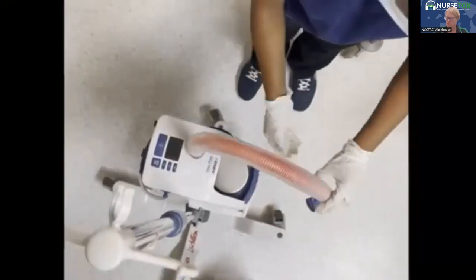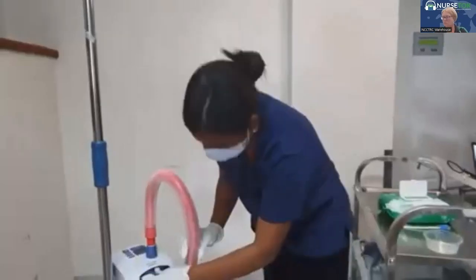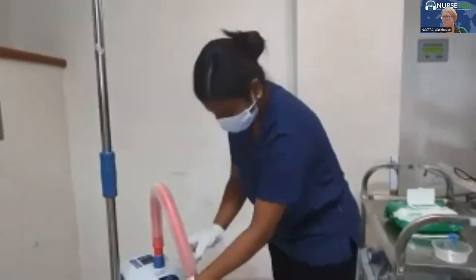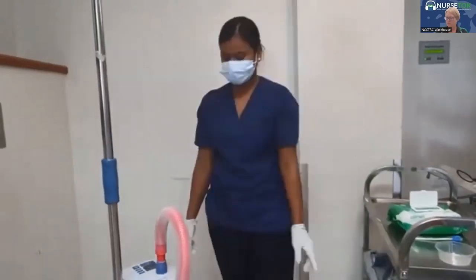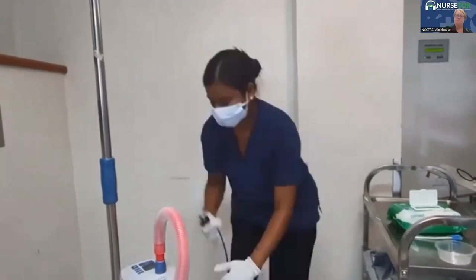Insert the blue filter cap onto the right port. Once you've connected the red disinfectant tube, you may now turn on the machine, pressing and holding the mode button for 3 seconds.